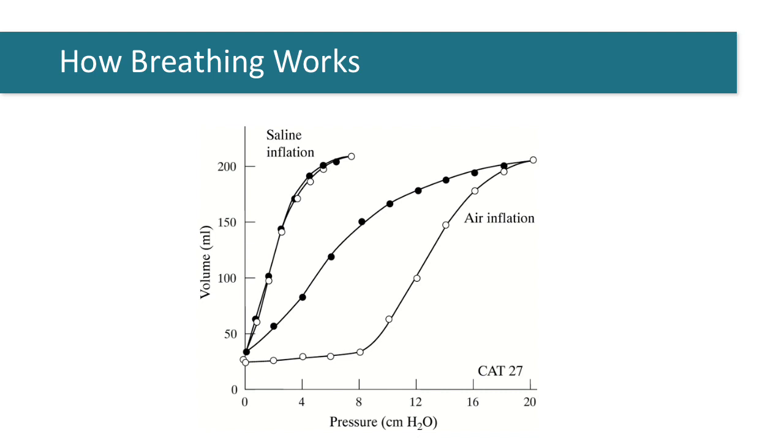Some patients will have a very large gain in lung volume, and in these patients, using a higher airway pressure is probably beneficial, while in others, the difference between the inspiratory and expiratory limbs of the pressure volume curve is very small. These patients have less recruitability and probably benefit less from the use of higher airway pressures.